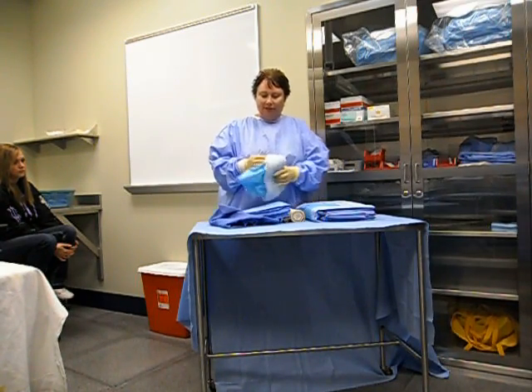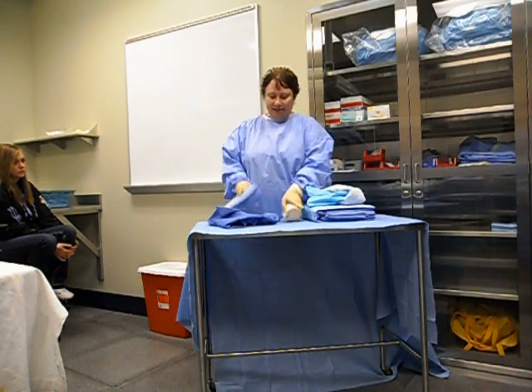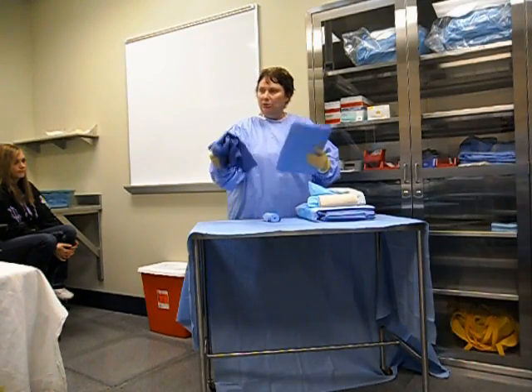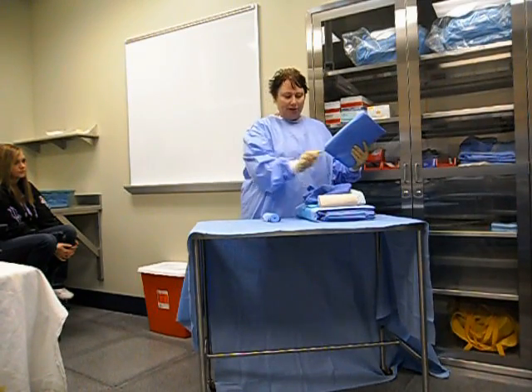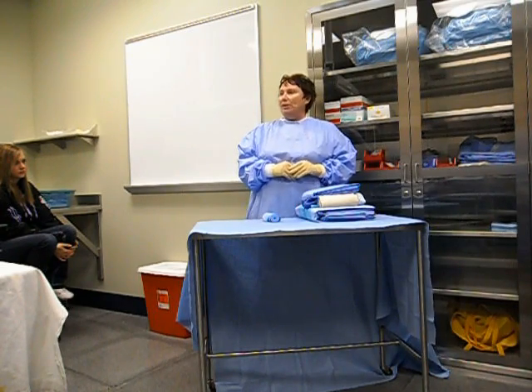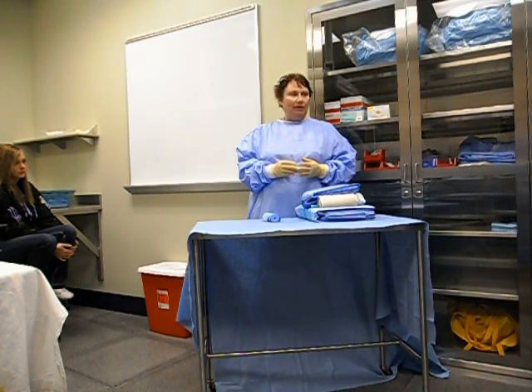We're going to have our stockinette, and in this scenario we'll use our Ace. We're going to have our towel with our perforating or non-perforating towel clip, and our drape — half sheet, three-quarter sheet, whatever.